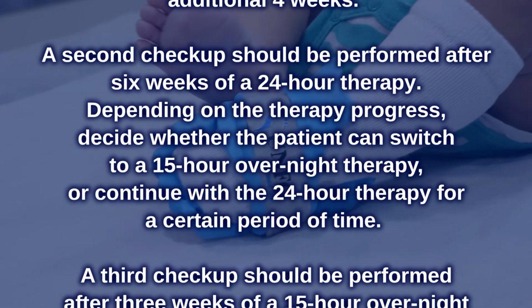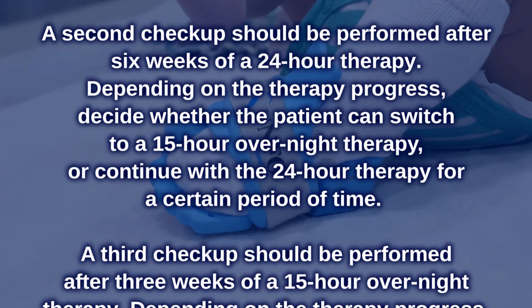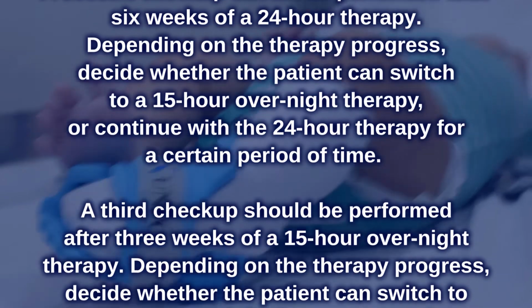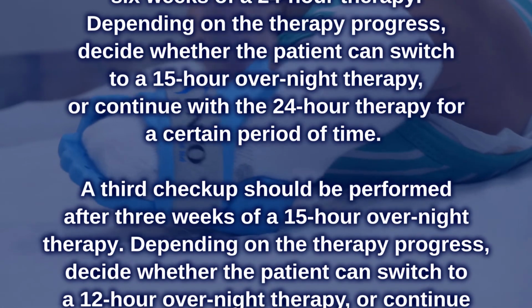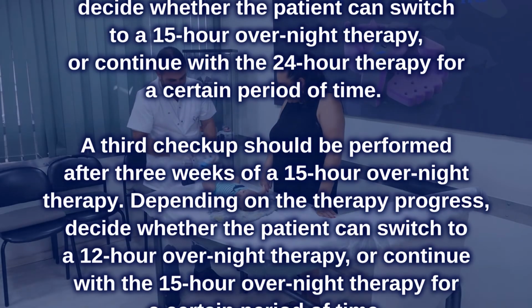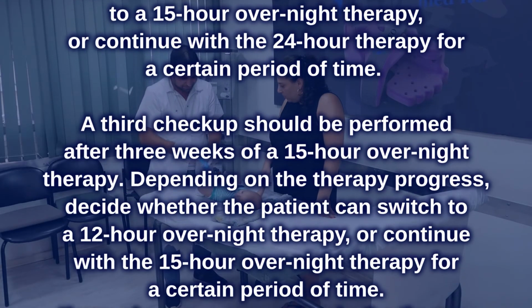Depending on the therapy progress, decide whether the patient can switch to a 15-hour overnight therapy or continue with the 24-hour therapy for a certain period of time. A third checkup should be performed after 3 weeks of a 15-hour overnight therapy.